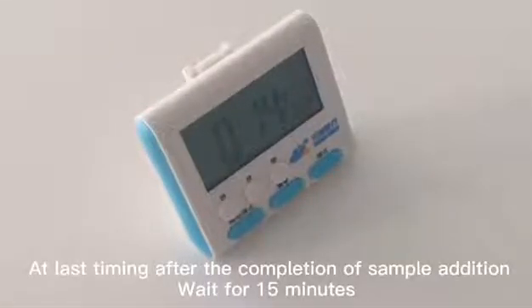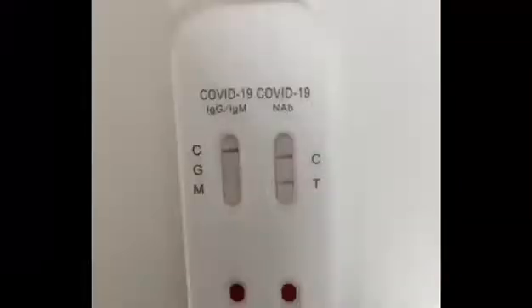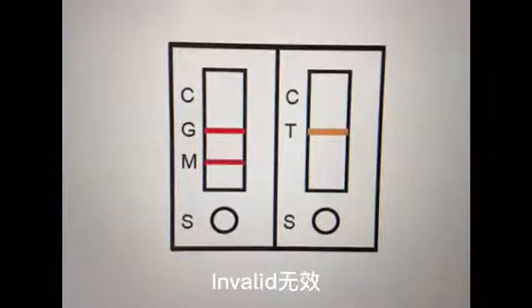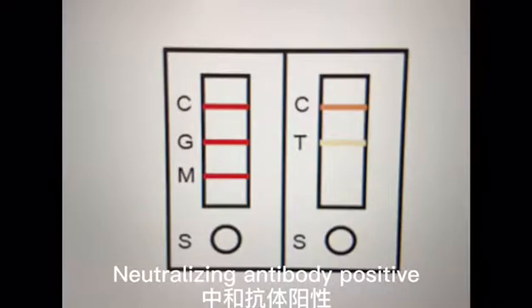After the completion of sample addition, wait for 15 minutes. Results: Positive (阳性), Negative (阴性), Invalid (无效). Neutralizing antibody positive (中和抗体阳性).